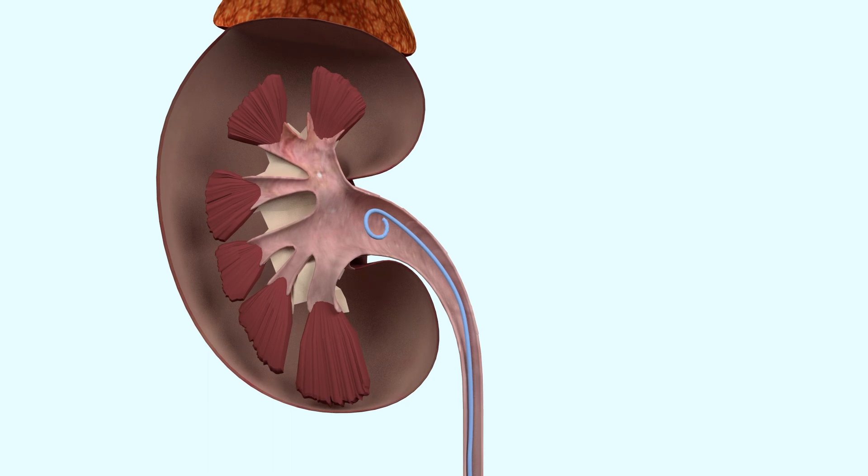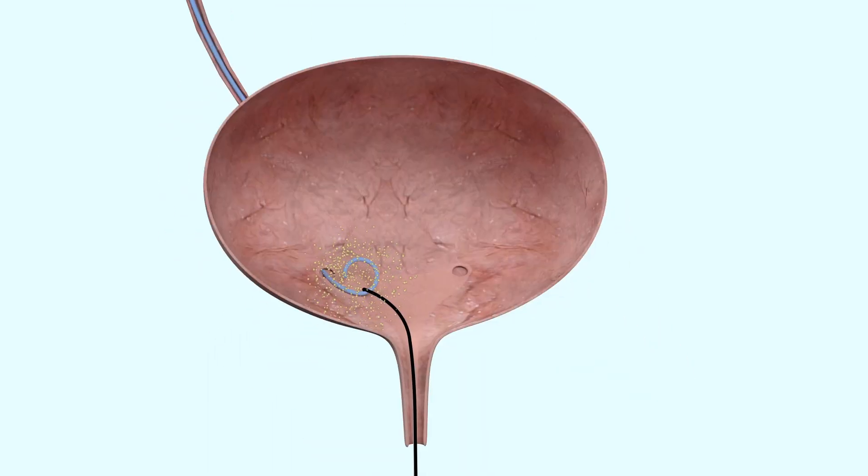A temporary double J stent on a string tether is inserted to allow the sand-like stone particles to pass in the ensuing days. The stent will be removed in the office after a few days and the treatment is now completed.